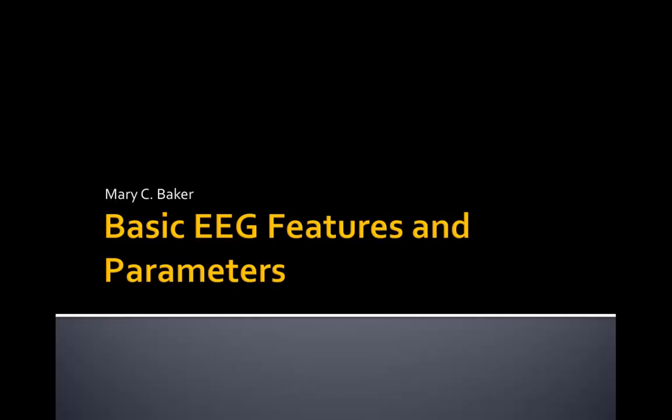All right, in this lecture we want to discuss some basic EEG features and parameters. By feature, I'm using this in the pattern recognition sense of the word. In other words, do we have some number that we can calculate from an EEG signal that would give us a way to look for what are often referred to as biomarkers, or ways that we can identify different groups as far as a disease process, or maybe different reactions as far as how the person is being stimulated.